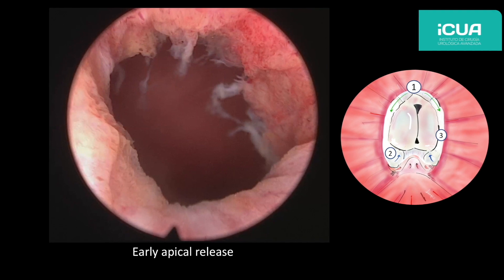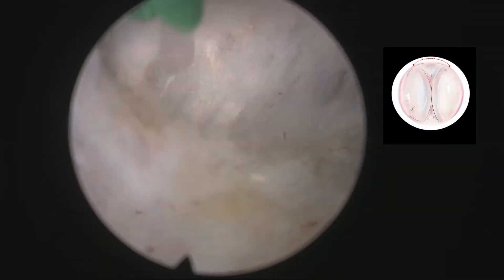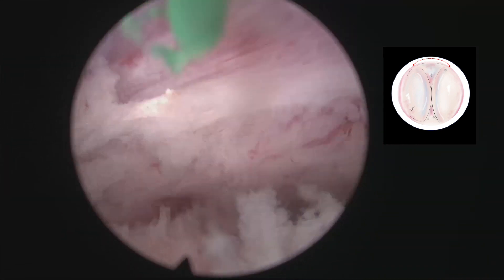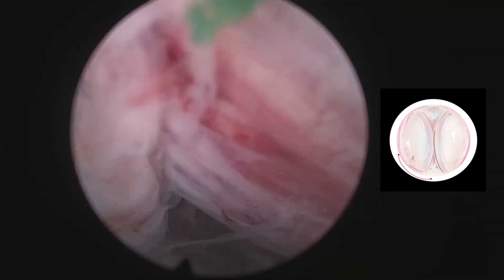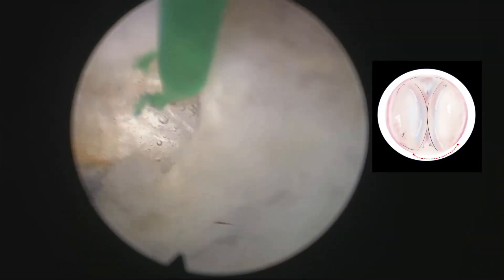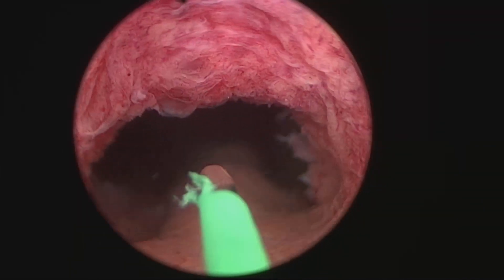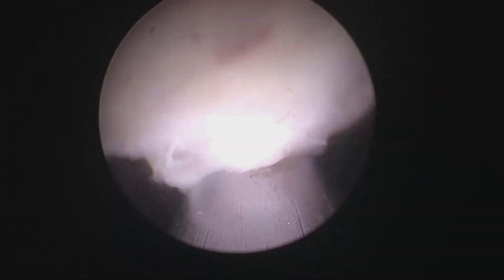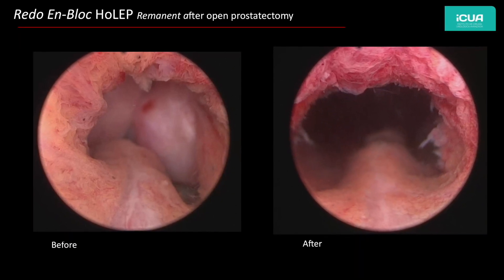You can see the sphincter is perfectly preserved, and from that moment on the adenoma is going to be dissected circumferentially. We have learned over time that despite the appearance that the fossa is quite well resected or free from adenomatous tissue, in these redo patients one has to look for the proper plane and follow it, because many times we see adenomatous remnants even in areas where apparently the tissue was properly removed. This is the pre- and post-operative aspect.